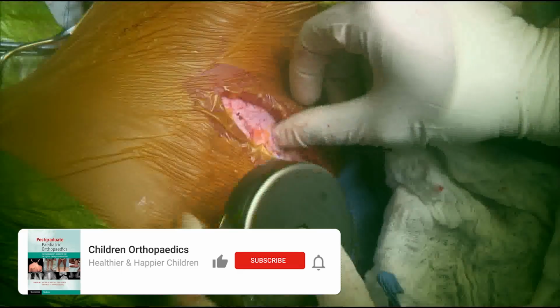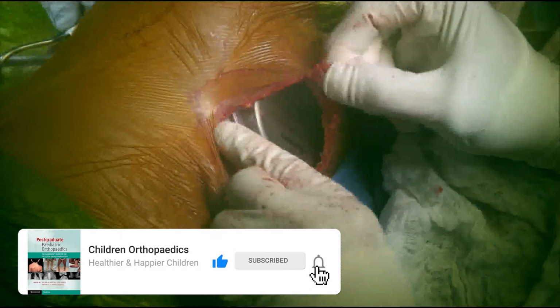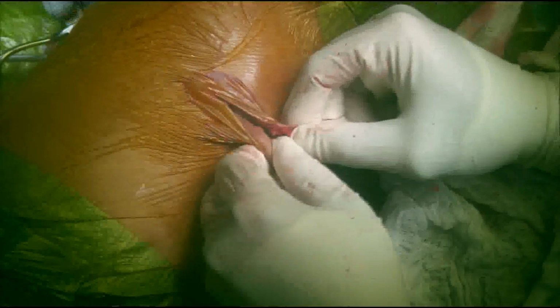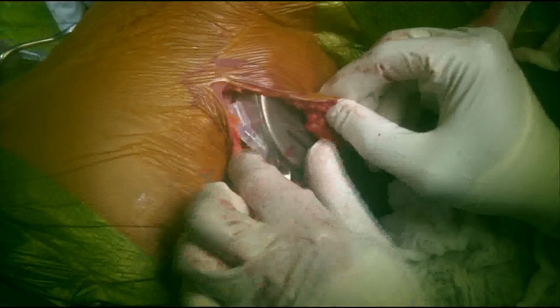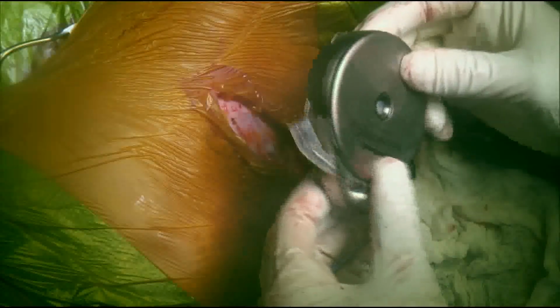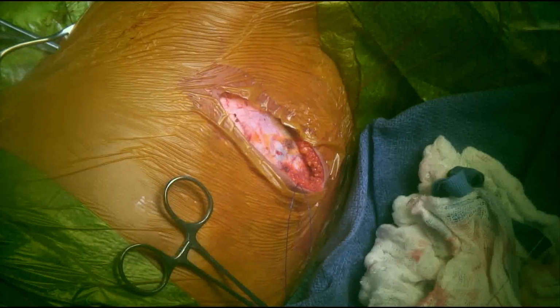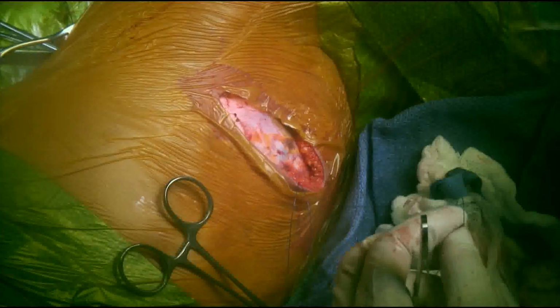After completing the preparation of the abdominal pocket, the baclofen pump can then be inserted into the pocket in order to check for proper fit and tightness of the surrounding tissues and the skin. Once you are happy with the fit of the baclofen pump, you can start preparing the anchoring sutures, which would also be non-absorbable, and they are usually anchored to the 4 corners of the baclofen pump.